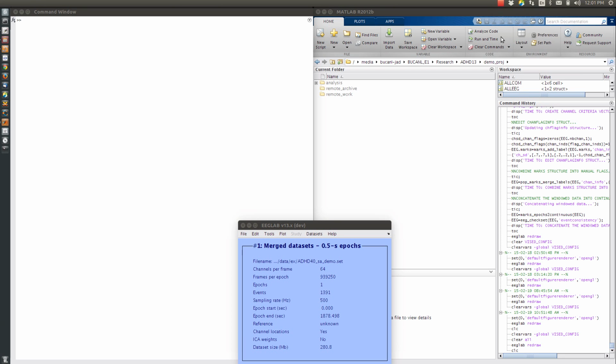I'm James Desjardins, EEG technologist at the Lifespan Development Research Center at Brock University and high-performance computing consultant with the SHARCNet HPC Consortium of Compute Canada. This presentation is a demonstration of the software extensions for EEGLAB that I'm developing for implementation with high-performance computing resources.